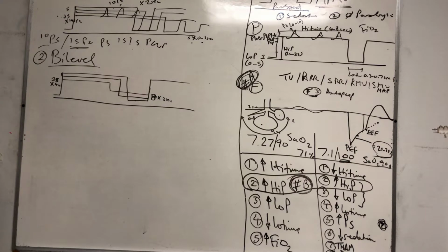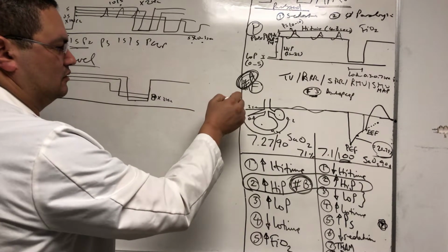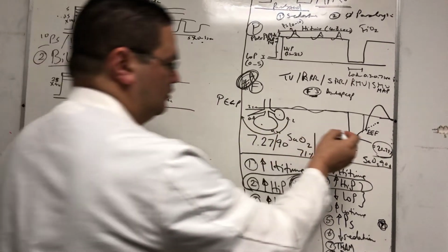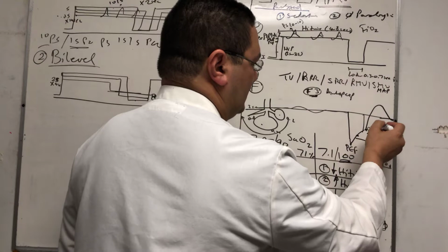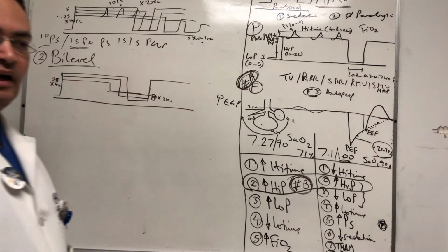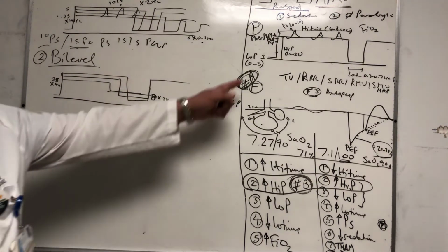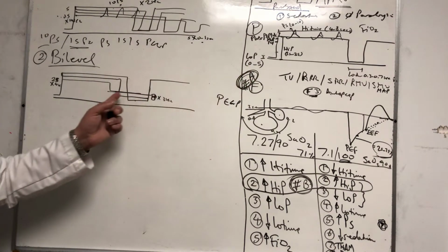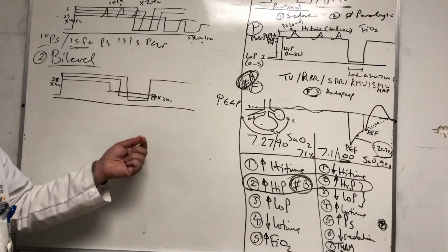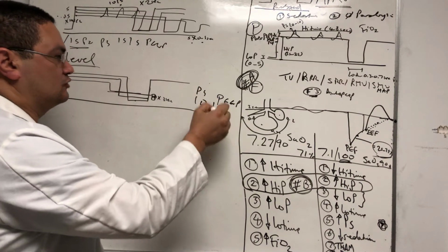Now your PEEP is 8, right? Because 3 seconds is enough. Exactly. Now your PEEP is 8, because 3 seconds is enough time for any lung to reach the baseline and stay on the baseline for a long time. And by the lung reaching the baseline, that means the lung started seeing what? Started seeing the low pressure. So when you have 3 seconds here, then the lung actually has seen the 8, so the PEEP is 8, and whatever pressure support on top of it. So this is actually a faster way.